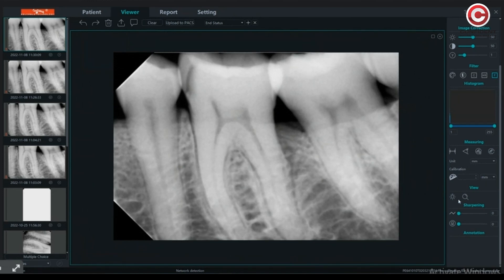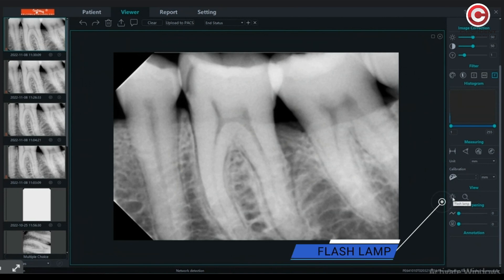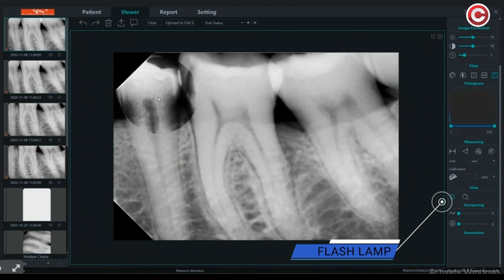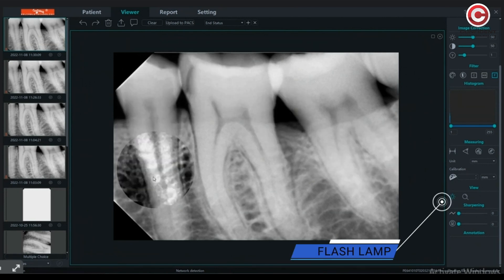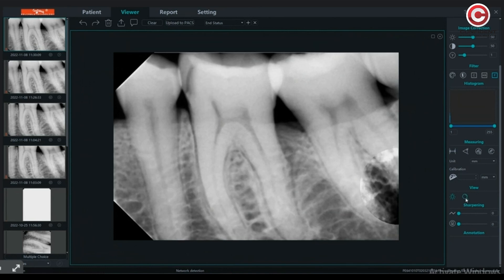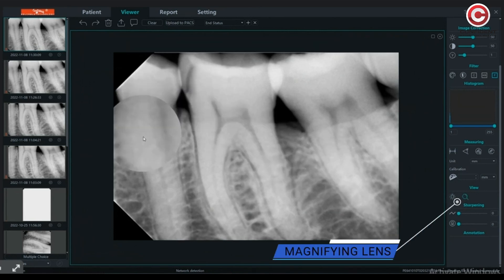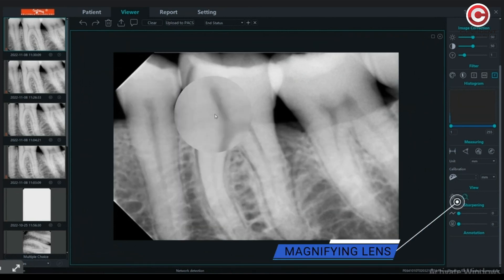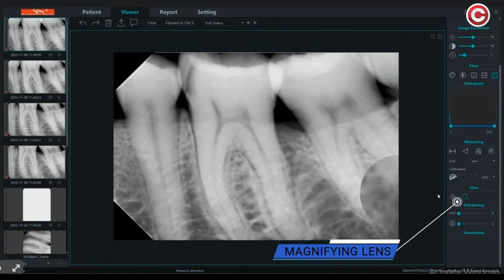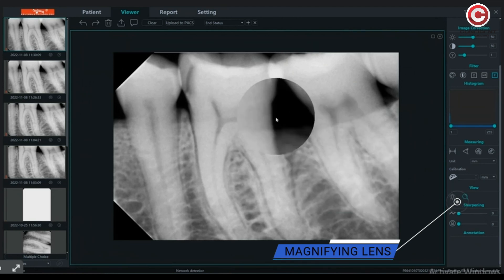You can turn on the flash lamp using this tool. Move your mouse anywhere in the image to see that portion illuminated. Similarly, when you choose the magnifying tool, you will find the targeted portion is magnified for closer inspection.